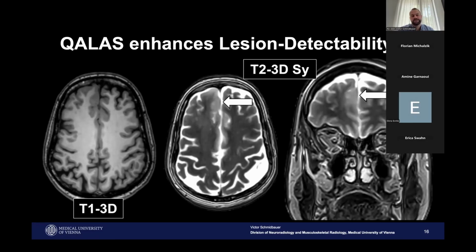You can see there is thickening of the gray matter, white matter interface in the right frontal lobe. And this is in keeping with a low-grade glioma. This is, of course, helpful to get a lot of information based on a single sequence acquisition, and is helpful when interpreting functional MRI data, especially if there is no prior imaging data available. So this nicely proves that this sequence enhances such protocols within a clinically acceptable examination time.